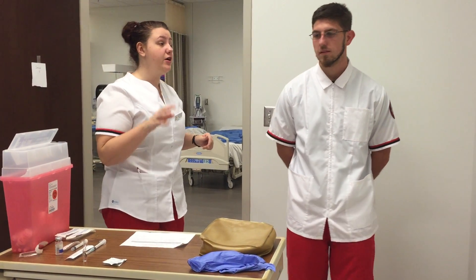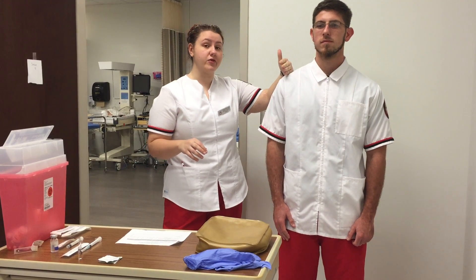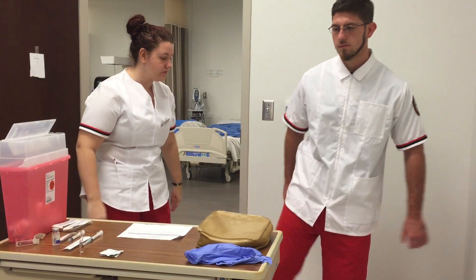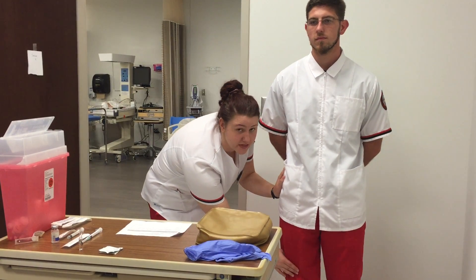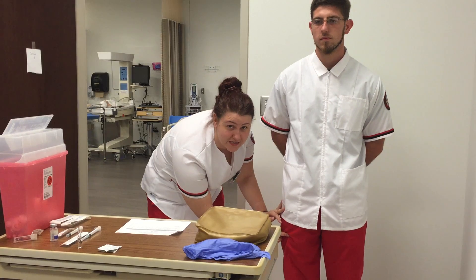Now for the injection sites. For the intramuscular site, we have the deltoid — I find the acromion process, measure down, and inject right here. For the vastus lateralis, I place my hand on the greater trochanter, locate the patella, and inject right here in the middle of the vastus lateralis.